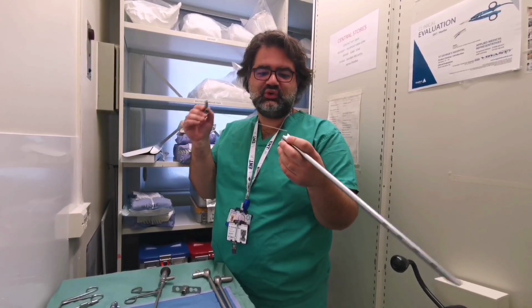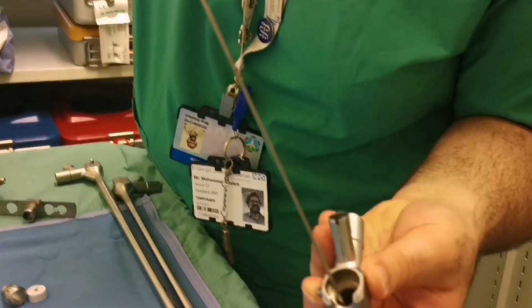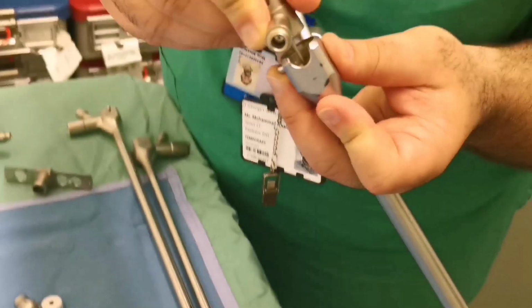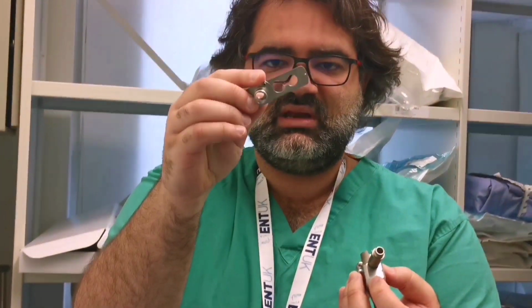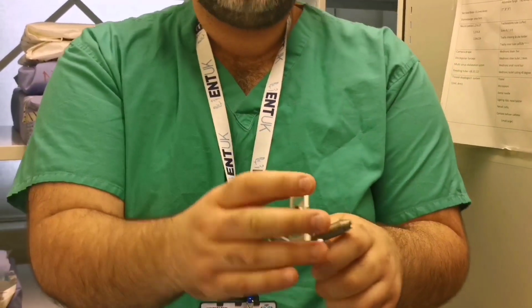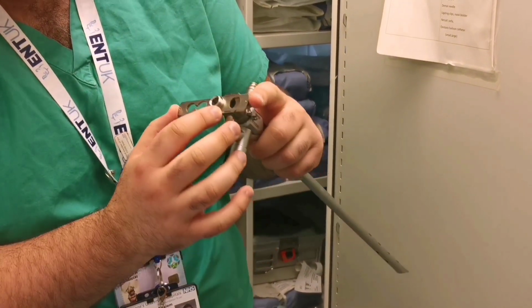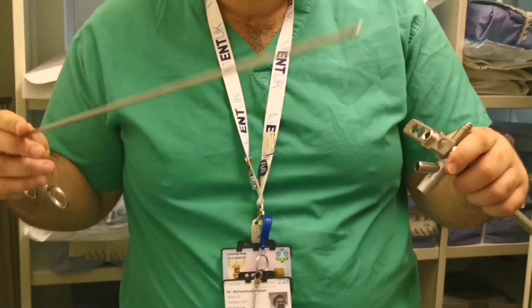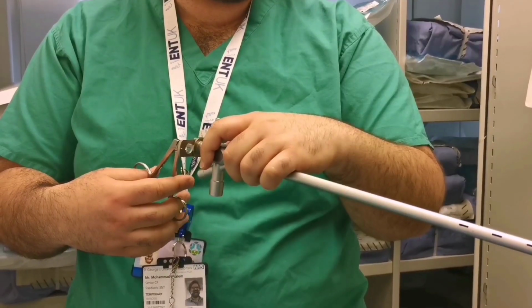You can use the ventilating bronchoscope with the light source. As we explained, there's a groove inside there that your light source needs to go into. It needs to slide into that groove, and everything, as we explained, needs to click in a vertical direction. And still use this 3-window adapter. You can close the main working area with that, and you can switch between either a glass window, where you're sealing the airway so there's no loss, and then you can switch into an open working area, which you can use and introduce your forceps inside and retrieve a foreign body. It would not be typical to use that.